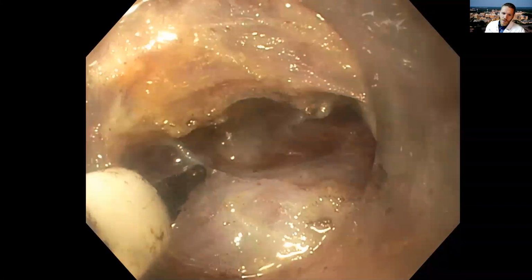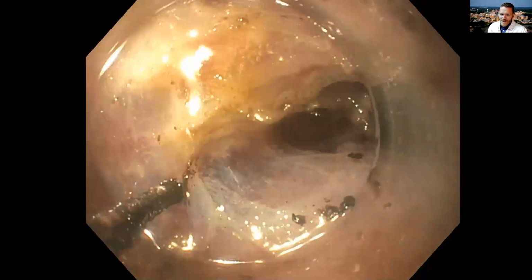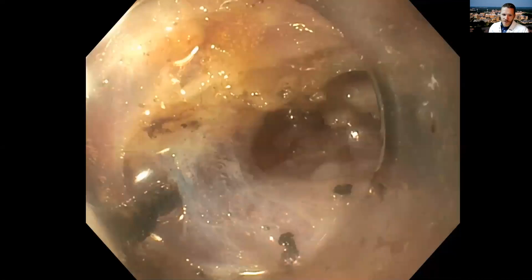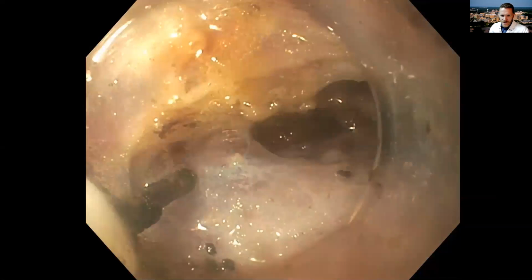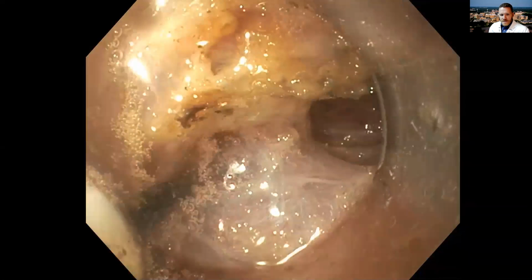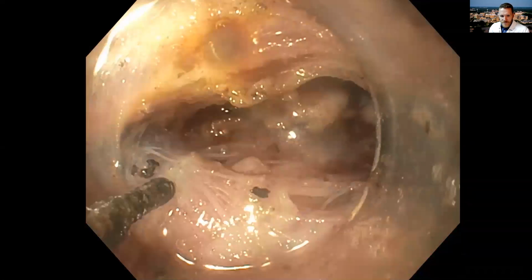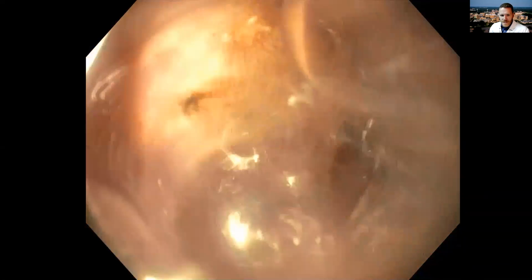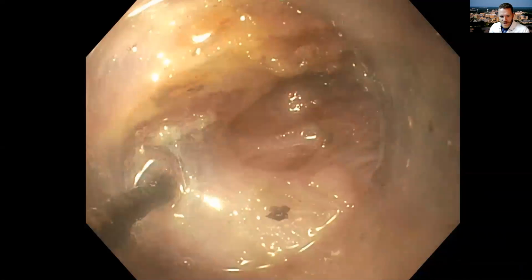This is one of the rare times in endoscopy where you suddenly see an opening of daylight on the other side and you feel good about it. So this is sort of an intentional perforation in a sense, where we're going to come out the other side of this tunnel underneath the tumor. I'm going to clean up some of the edges, and like I said, this is a several hour case, truncated down to a 4-minute video, but we're trimming down at the edges here.